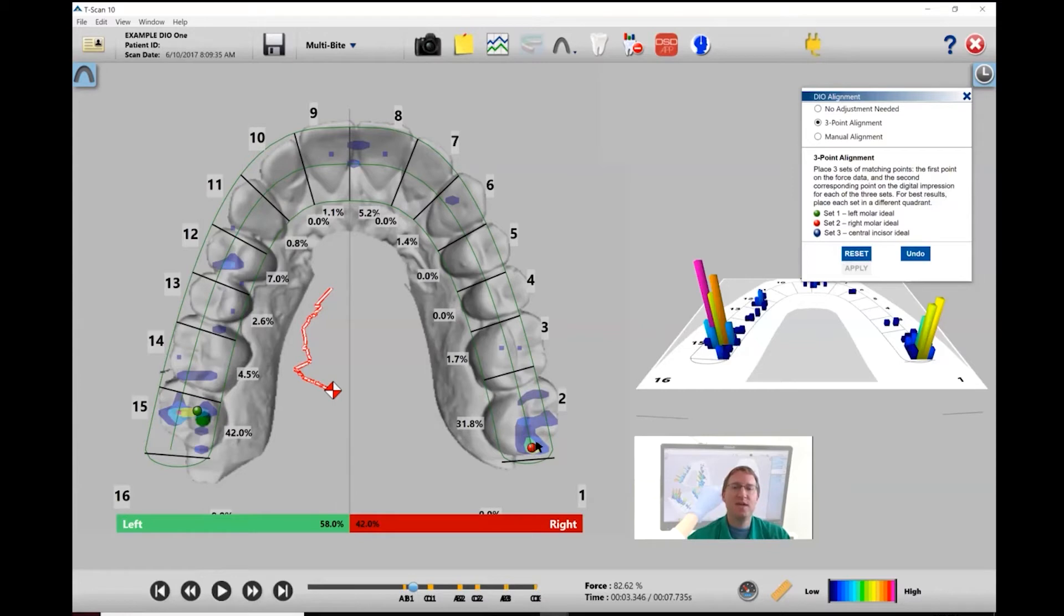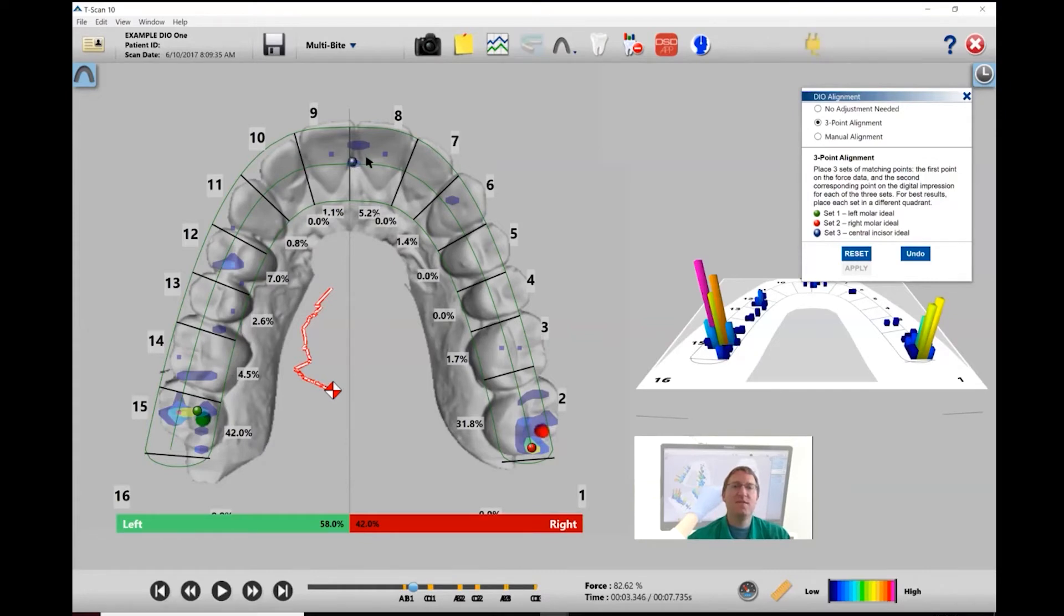Pick the forced data, find the right location, and then one more time for central incisor—forced data, find location, and then hit apply.